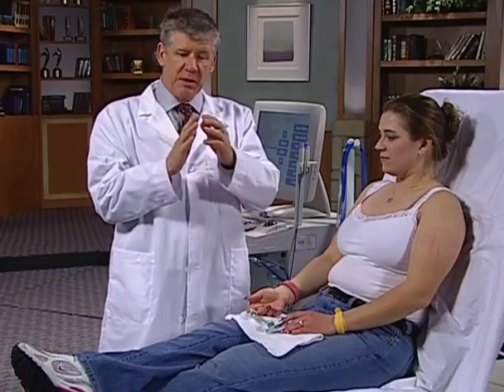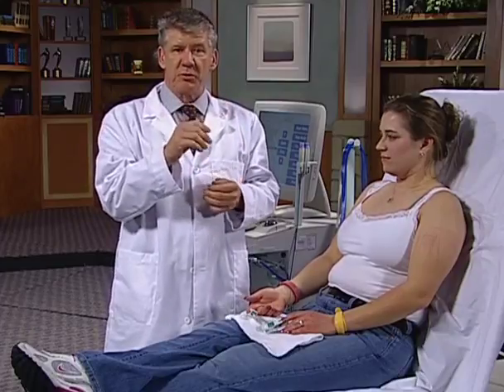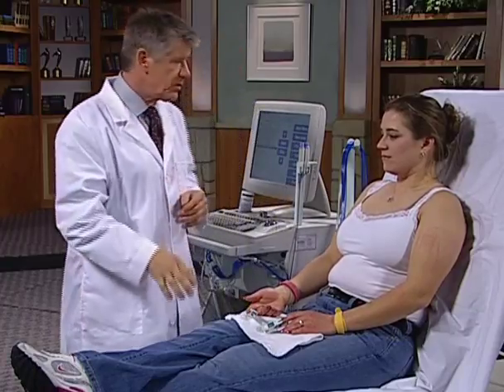Just a little warning on this PPG testing. There are some patients who, when they're in the 180 degree position and they superextend or hyperextend their fingers, can cause a decrease in the digital perfusion, which is not related to the thoracic outlet. It's just related to the arterial complex and the digital arteries. So don't have the patient hyperextend their fingers. We want that somewhat relaxed when they put their hand straight over their heads.